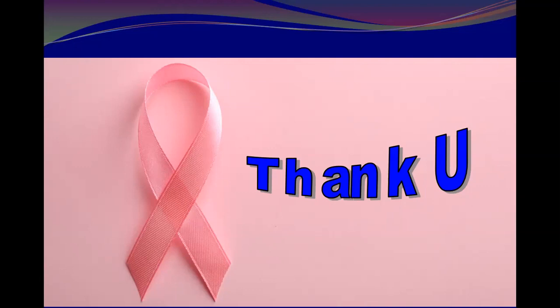So the fat lobule paralleling the parenchyma, coming from this side and this side, becomes soft, and the parenchyma in between becomes firm or hard. That is why it becomes palpable. The most important thing is that it is not three dimensional when I turn the probe 90 degrees.